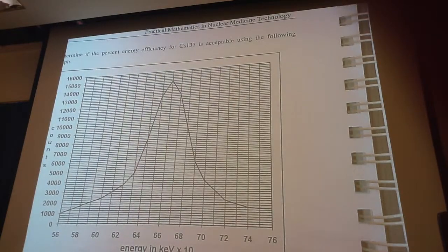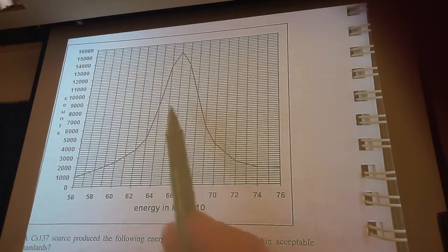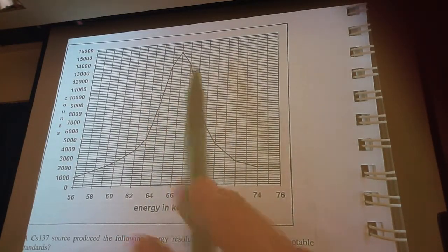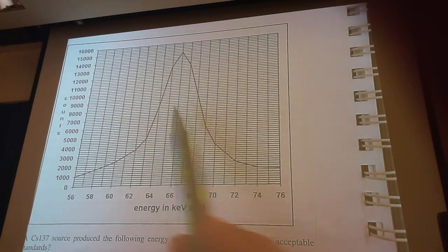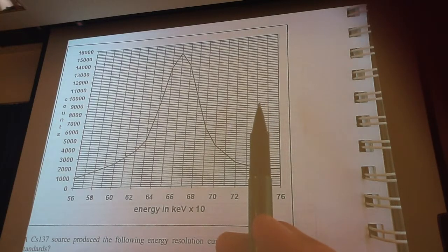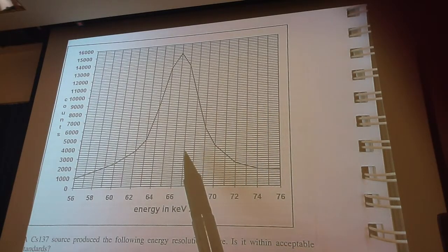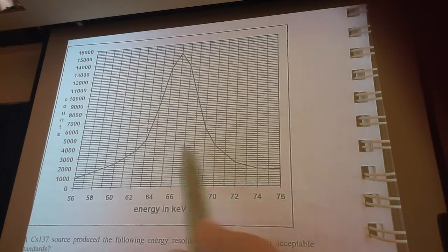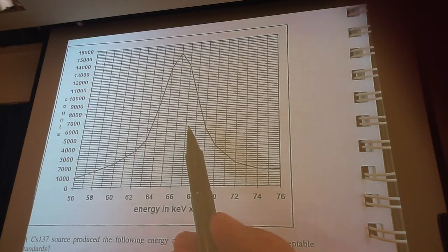Okay? Some other things that we have here. What you will notice is the sharper your peak and the narrower the distance between the width, the better your camera is going to perform. It has better resolution. Okay? So when it gets wider, that's bad. And remember, I also told you that we do this to measure the bolus injection. Remember that?